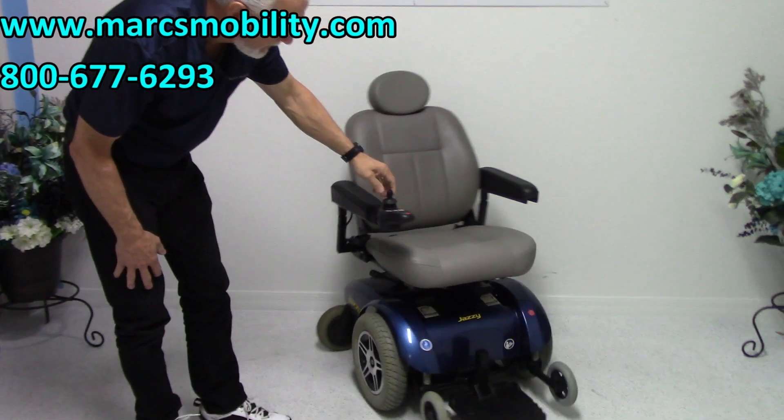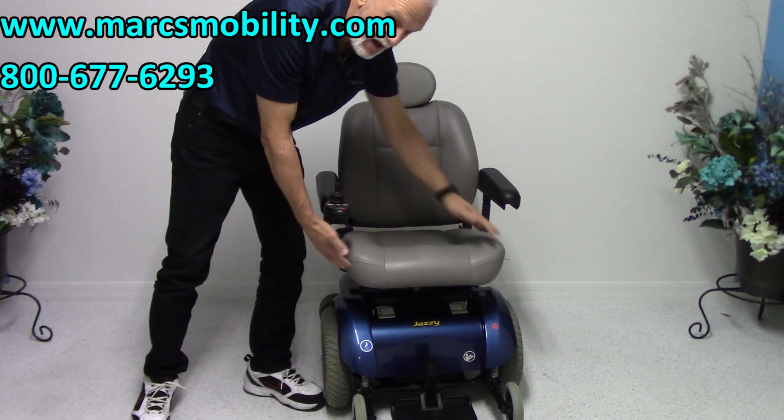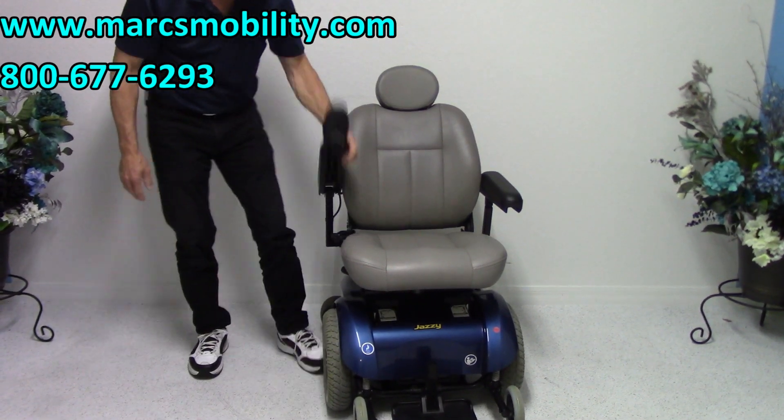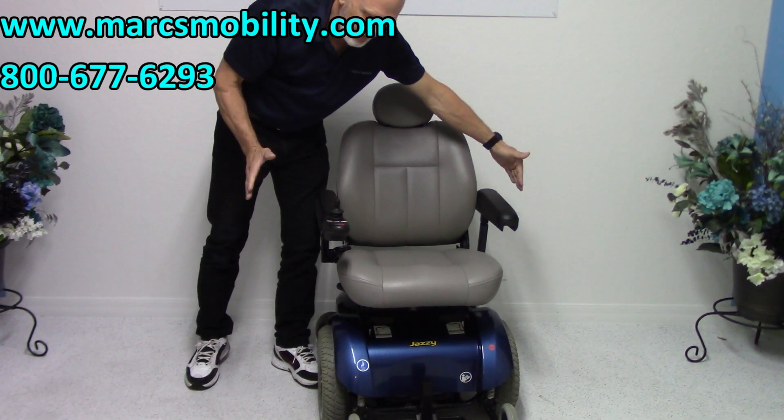This power chair has a 20-inch wide by 18-inch deep seat. The arms do flip up, both of them, and they also go out if you need more width.